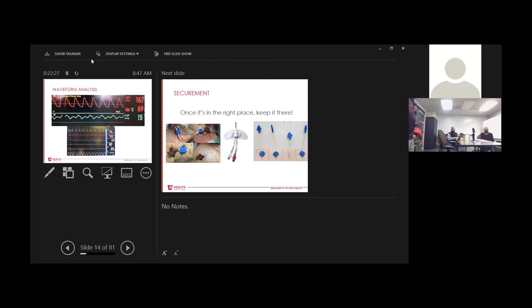this is an arterial waveform. A couple ways we know. It is large, right? This guy has a blood pressure of 167 over 69. It has a dicrotic notch. You don't need to know all the nuances perfectly of, is it a great waveform? Is it perfect? You just need to be able to recognize arterial. And an arterial pressure is going to be way different than a venous pressure, right? So if you're 50 or above, you right away know you're arterial. If you've got clear pulsatility, like this, or that dicrotic notch, you're arterial.